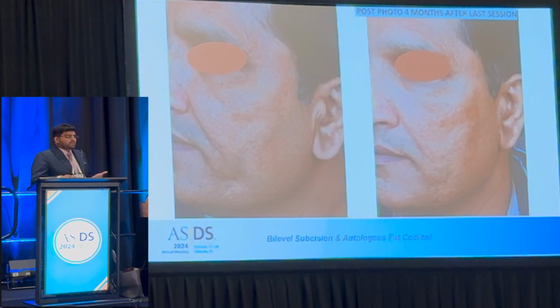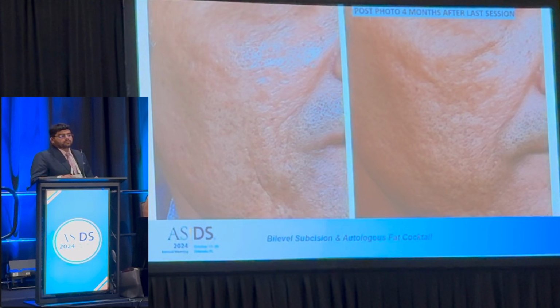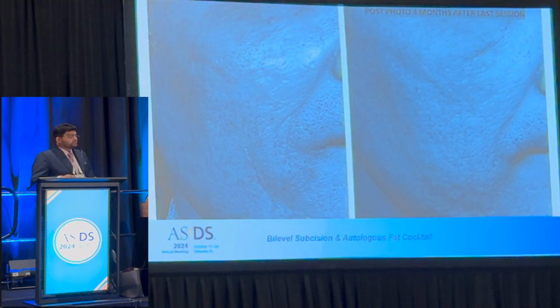The best treatment for these kinds of topographical irregularities is usually a full ablative laser. Now, I've not done that in this patient, and that's the limitation. But if you're able to do a full ablative, we can achieve further improvement. This is the same side in black and white, which helps appreciate it better. The other side.